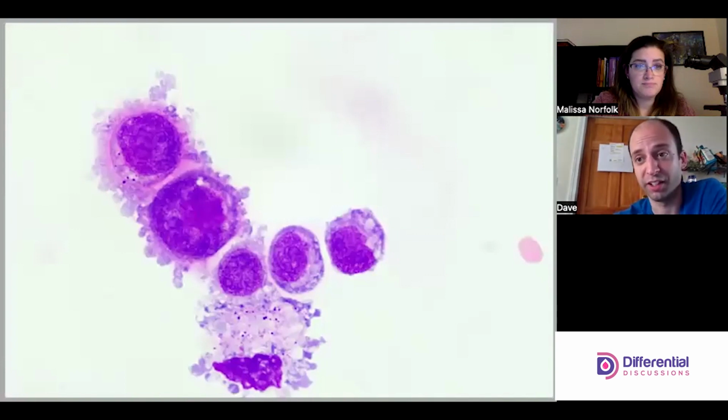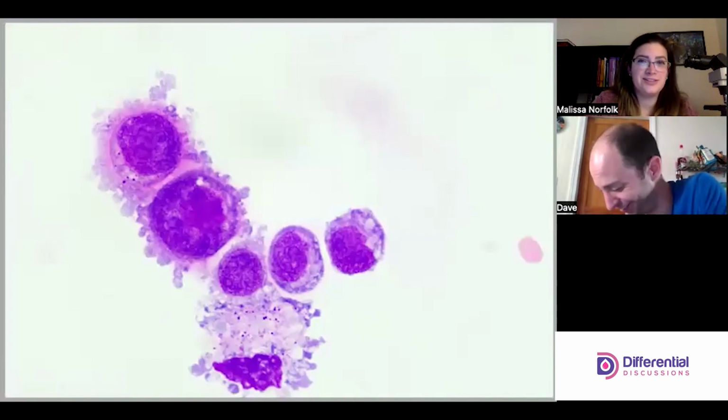I think this has about taught us everything it's going to teach us. I think we're just going to see more of the same.